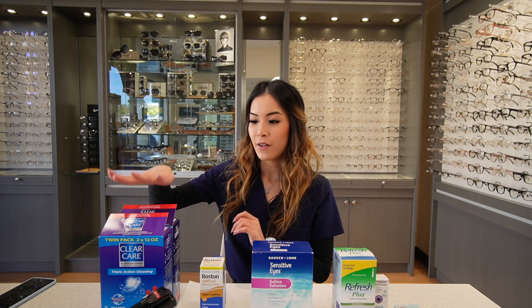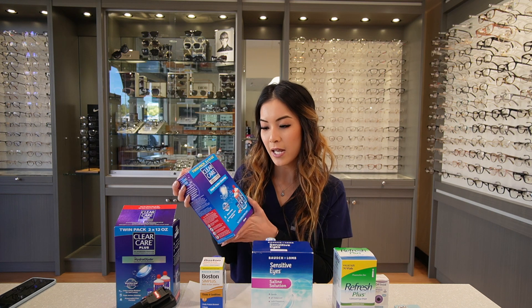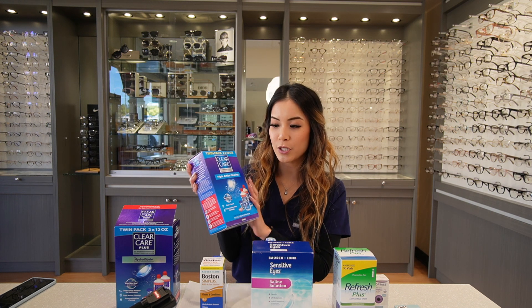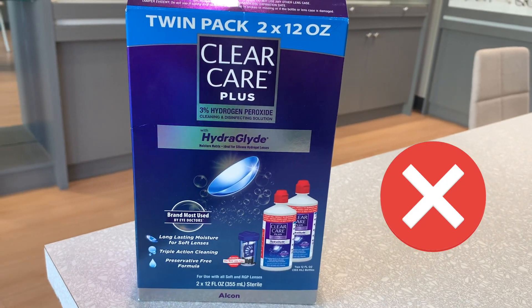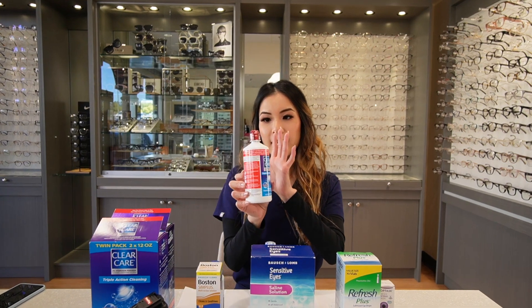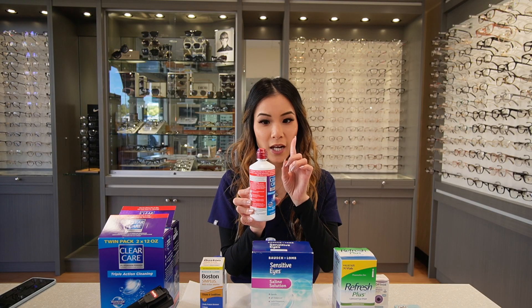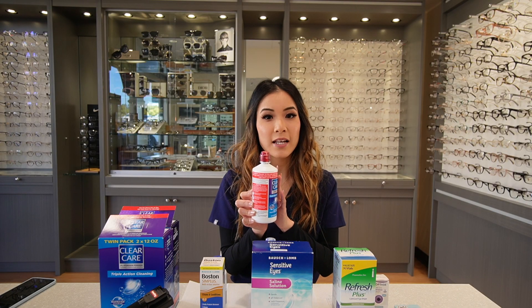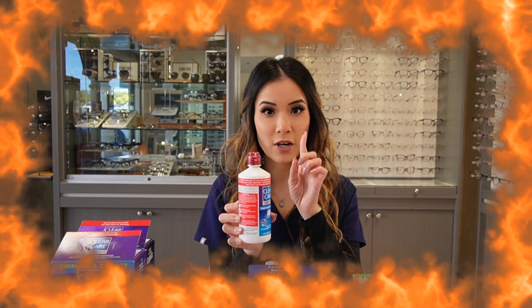In front of me, you'll notice there are several different bottles. The first bottle is Clear Care. Clear Care is a hydrogen peroxide solution. When you purchase Clear Care, make sure you purchase the Triple Action Cleaning Kit instead of the HydroGlide Kit. Notice that the bottle has a red cap — this indicates that it cannot be put directly into your eyes, as it will burn your eyes. So always remember, red cap cannot go into your eyes directly.